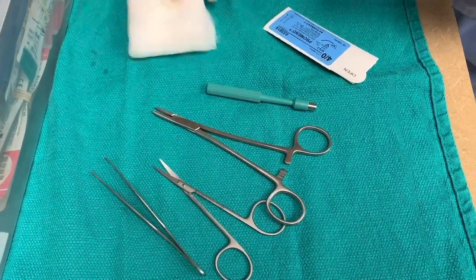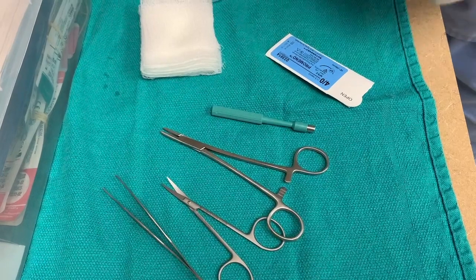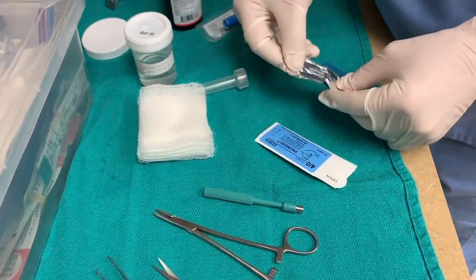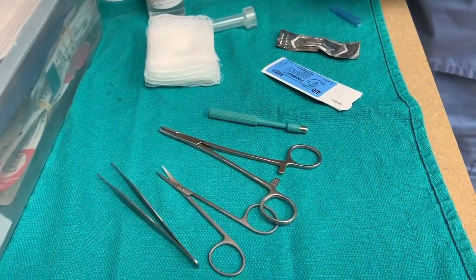I'm also going to take the first sample with the sterile punch and submit it for culture. I'm going to use the scalpel blade to chop off the superficial portion of it.